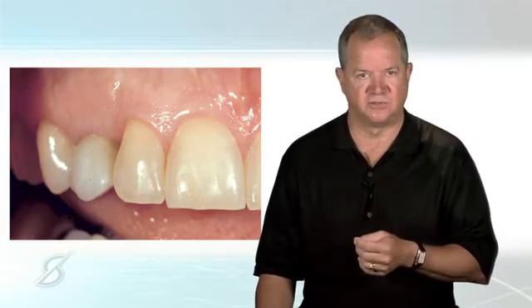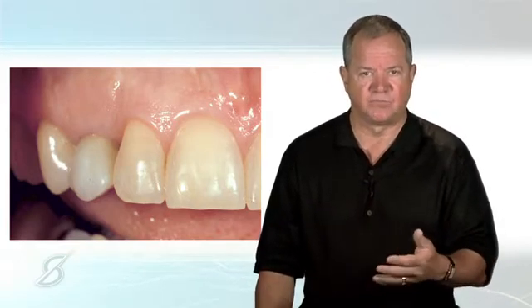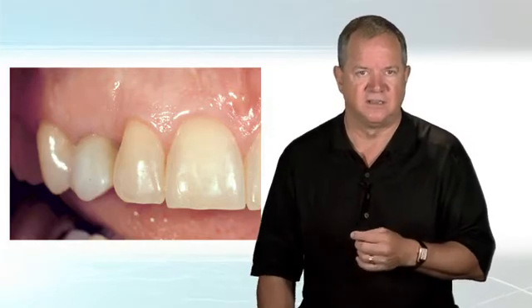But in implant dentistry, we're totally dependent on contour to create the form of the tissue. Now, to show you a little more detailed steps on how that could be done, and in this segment I'm not going to go through how to make temporary restorations because we cover that in other segments, but I just want to show you this whole concept of how we manage temporary contour to get the tissue we want.